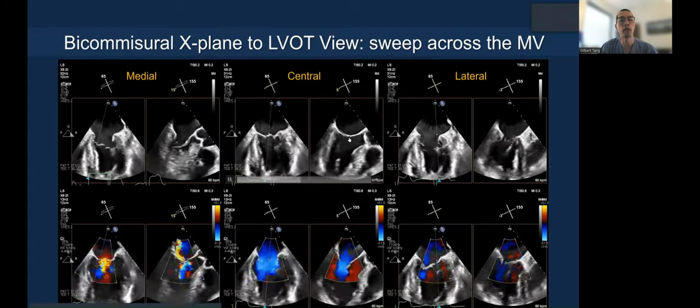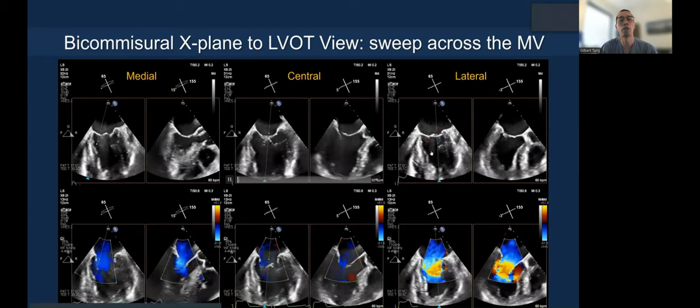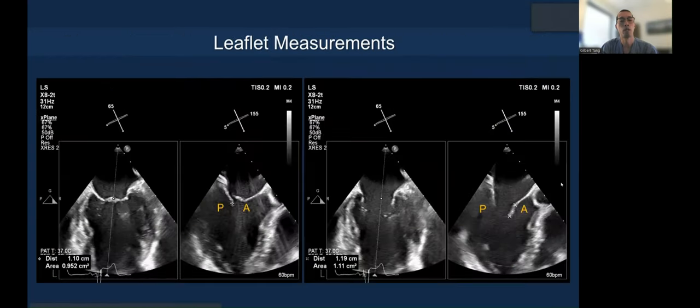In this case, you can see there's a flail A2, but also the ventricle is dilated. We also measure the leaflets you're trying to grasp. The important reason is that when you close the clip, you want to see the residual leaflet length and subtract the two to determine how much leaflet is inserted into the clip.